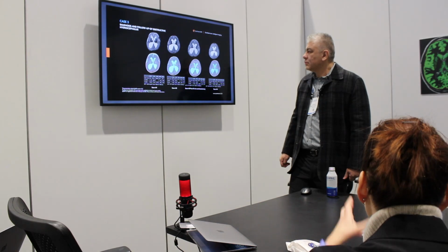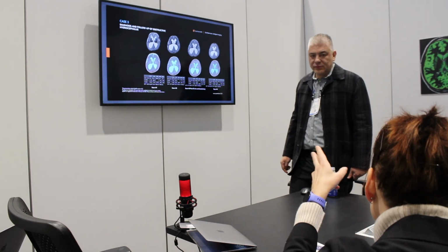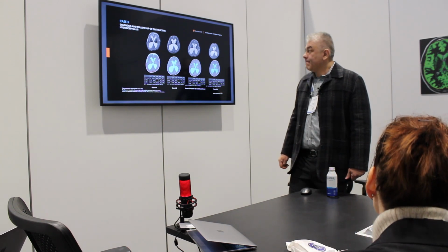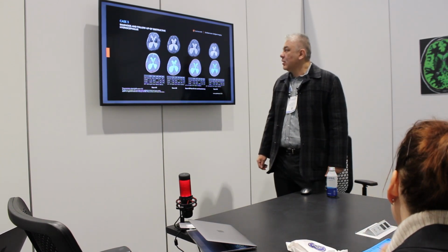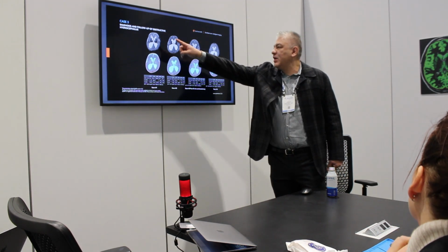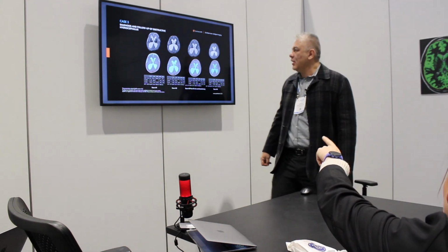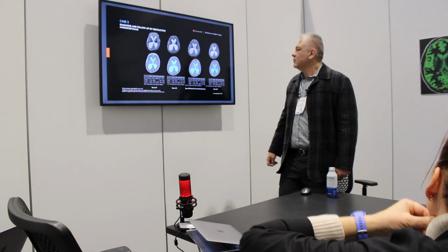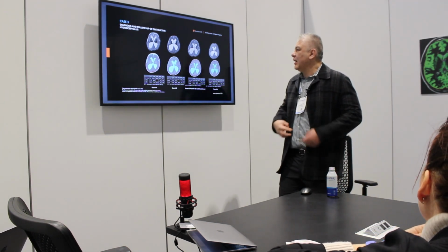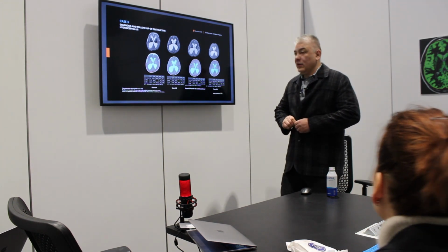I want to say, even people who don't believe the numbers in this case, we also have a hint in the images, right? You can see. We agree on that? Yeah. What you're saying is that the subarachnoid spaces are bigger than here, like from the third to the fourth. Yeah. We can see that, right? Yeah. Absolutely. But now we can have a number for it. It's minus 100.